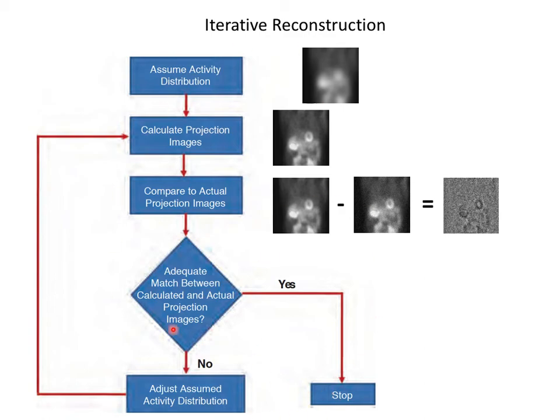So this is called iterative reconstruction. I think probably in nuclear medicine it is now the primary way of doing reconstruction because you're dealing with noisy samples. The reason they're noisy is because you need, say, 180 views, and you need to integrate up the amount of counts per each view, and the agent itself is decreasing. The intensity of the agent decreases over time. It has a half-life, and so basically you're working down in a low signal-to-noise regime.